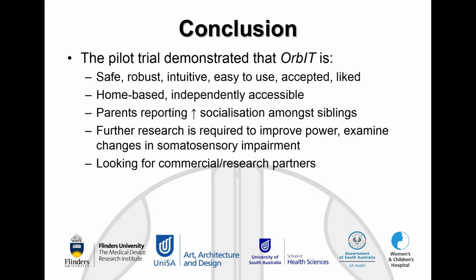We had a number of parents report increased socialisation amongst the siblings, so between the child that we gave it to, but it was a deliberate strategy to give it to the child and their family. So whenever I did a training session, I had the child and their parents and any siblings there so they could all understand how to use it and go from there.